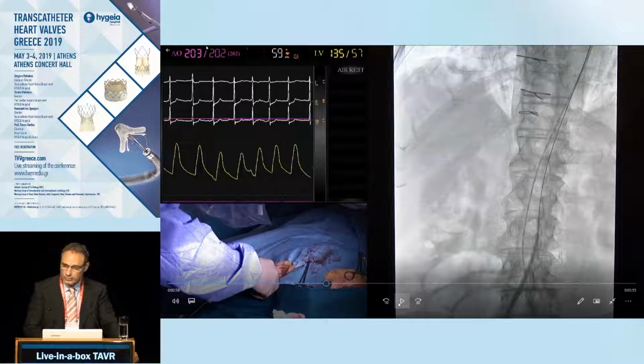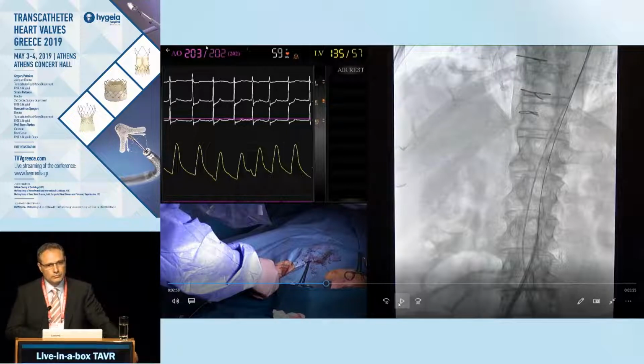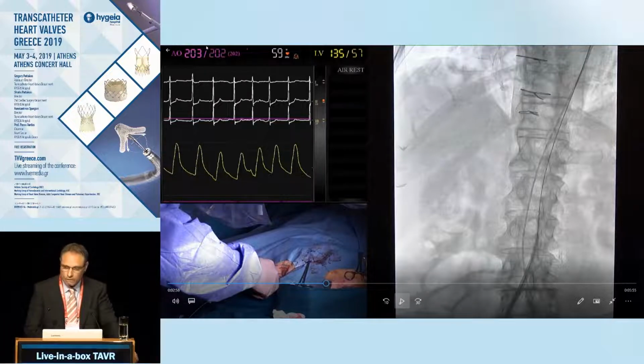Okay, because in the other cases it is easier to find the left carotid from the ascending aorta, so we don't manipulate it in the ostium of the innominate, essentially. Yeah, I understand, but that's what I'm saying, I just want to make clear to whoever is watching that this may be particularly helpful here, but it is not the general way that this device is used.